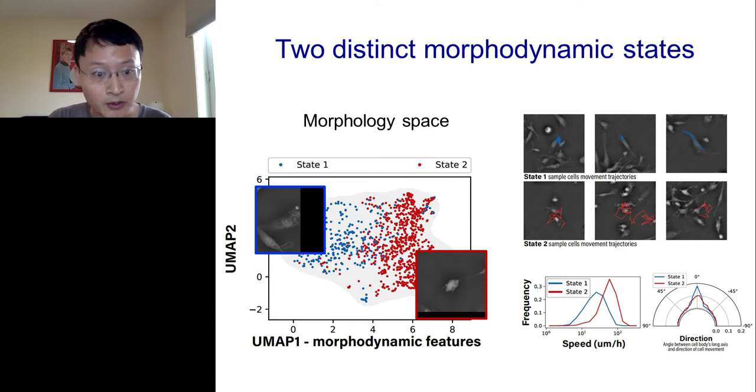So in the blue state, you have these cells that look a little bit like couch potatoes, right? Sort of lazy, they're large, and they don't move around too much. At the bottom here, you have these red cells, an example of a red cell in state 2. It's much more energetic, right? It's moving, it's spinning around, sometimes it's interacting with its neighbors. So it's much more active.